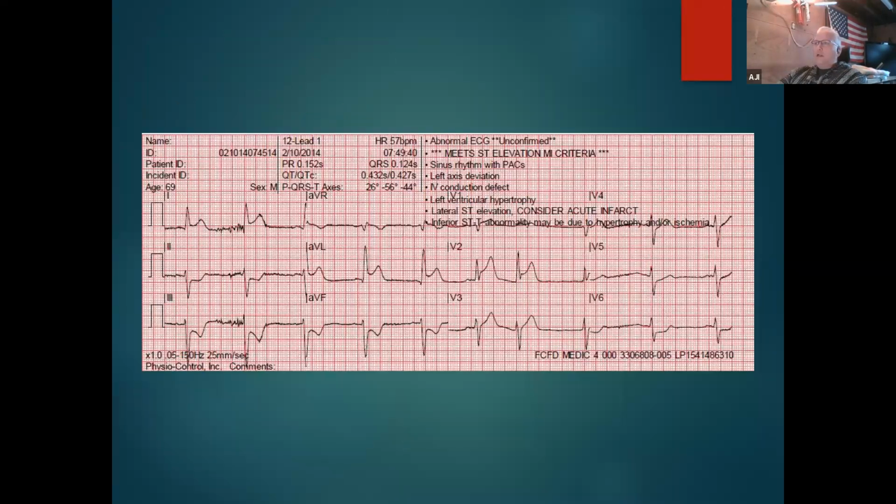So, here we go, what are we looking at for an EKG? This is actually produced by a LifePak 15, a Physio-Control device. When we do that, we'll print it out. It may come out that it's identified this as ST elevation MI, because it sees where it's happening.